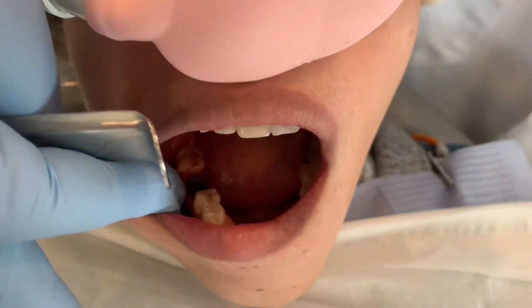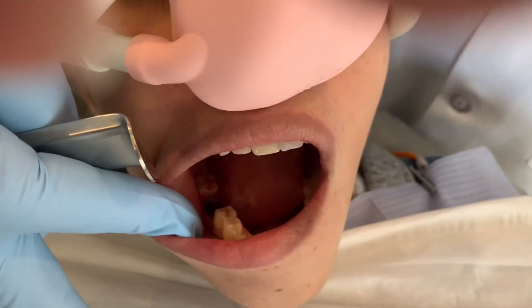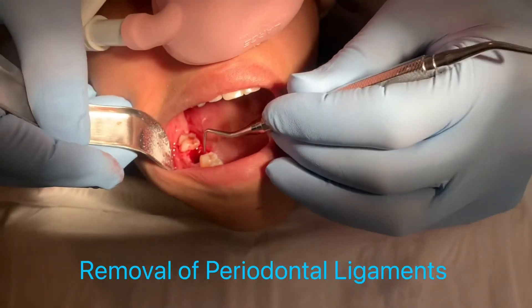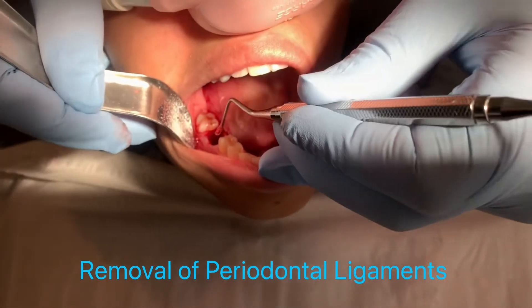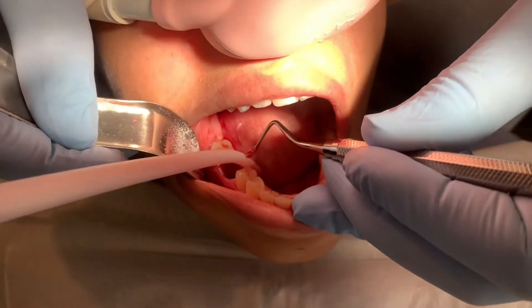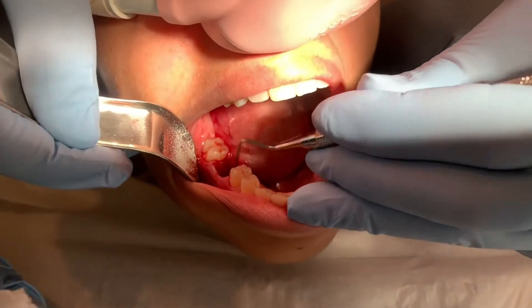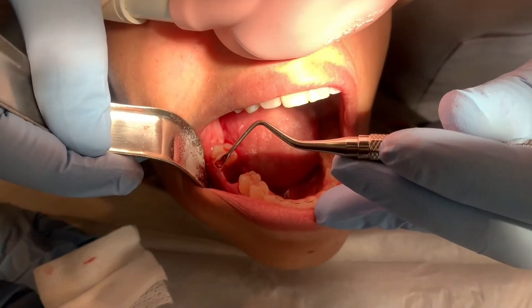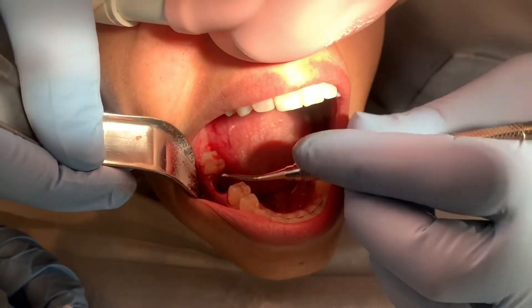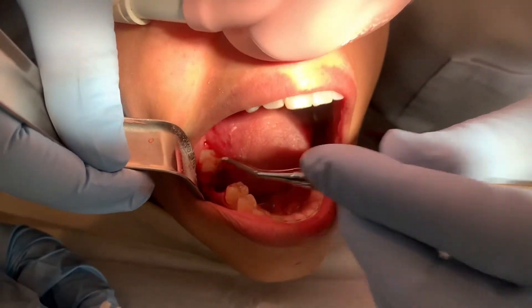The first thing I'm going to do is remove the periodontal ligament, which I do with this curette instrument. Sometimes there's a need for strategies that are a little more aggressive, but this tooth is fairly easy to clean. I'm going to turn the suction on. I'm just going to get this instrument down here and clean it. You can see these are the little fibers. You really want to make sure to get down to the bottom and get it all clean.